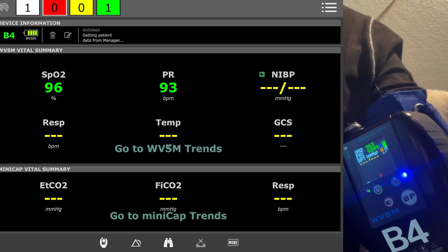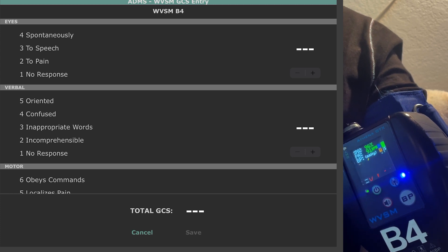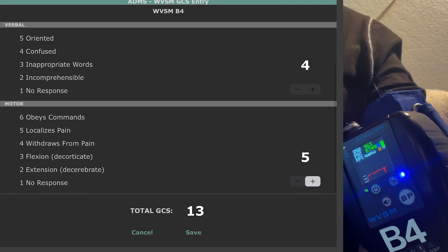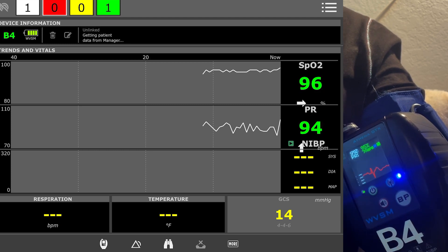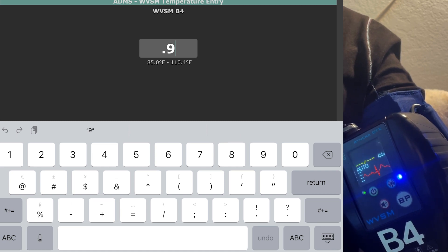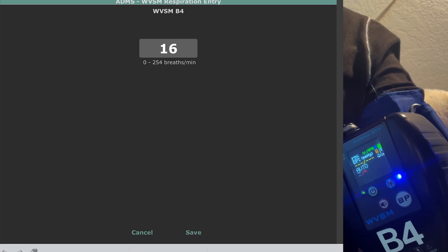As you can see here, I can look at trends. It will track GCS if you punch it in — you can increase those manually, hit save — GCS of 14, for example, or 15, and it'll update that for you. You can manually input temperature, like 98.6, and put in respirations. All that good stuff.